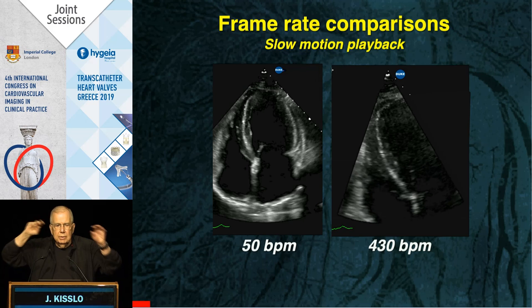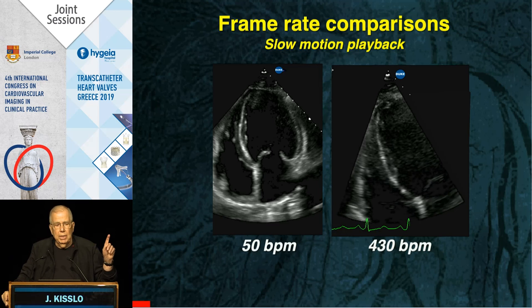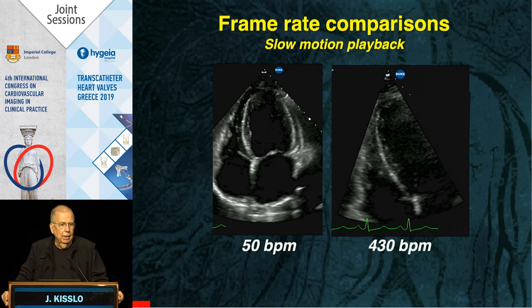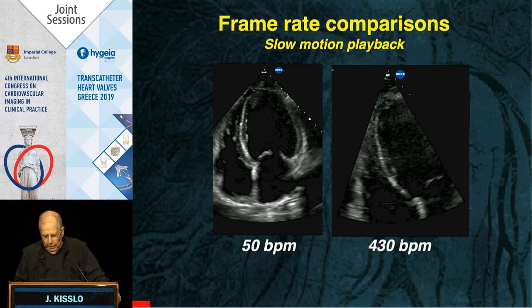You see these little movements going on in the septum — they are likely the conducting system. To remind you: 430 frames per second means imaging the heart every 2 milliseconds. If you can image the heart every 2 milliseconds, you ought to be able to see movements that are impossible to see at standard imaging rates.